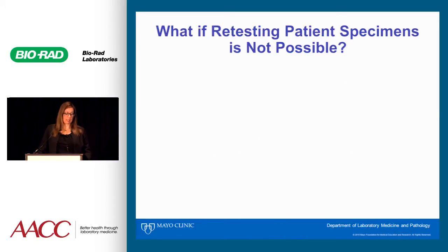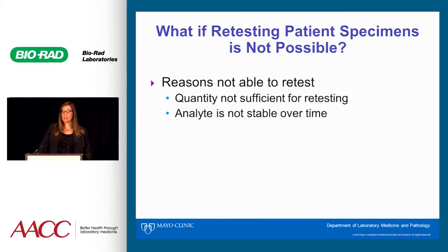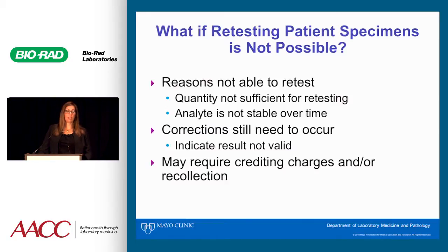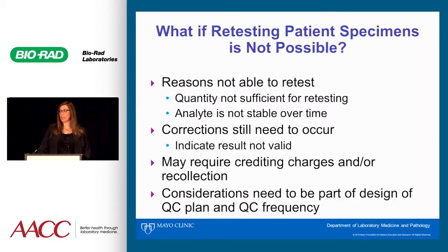What if retesting patient specimens isn't possible? The reasons might be insufficient quantity for retesting or analyte instability over time. We still need to treat these as errors — out-of-control conditions with erroneous results. Corrections still need to occur, and in the electronic medical record it should be documented that the result is not valid. You can note that routine quality assurance processes detected an issue and therefore the result is not valid. Depending on your institution's policies, you may need to credit the charge or order a recollection, and these considerations need to be part of the QC plan and QC frequency.